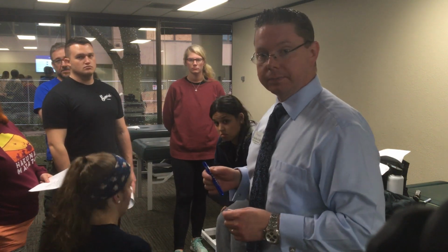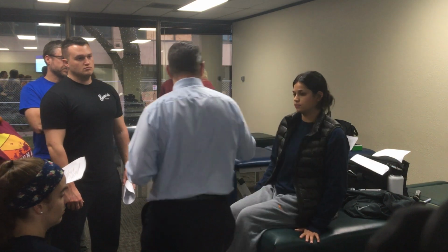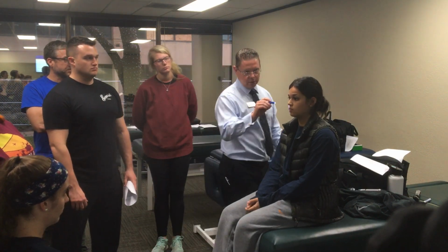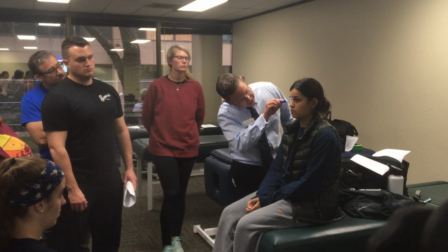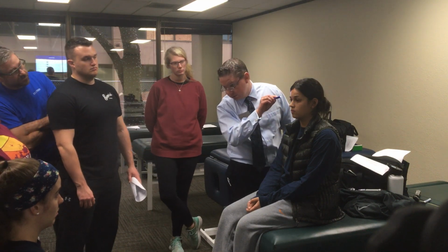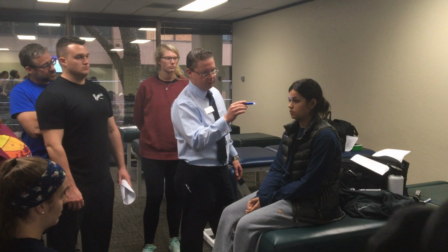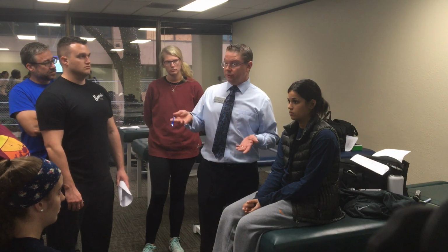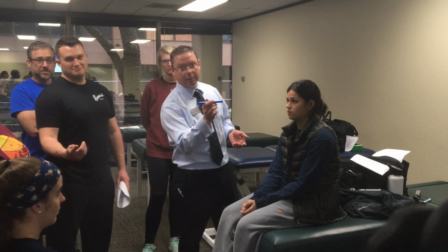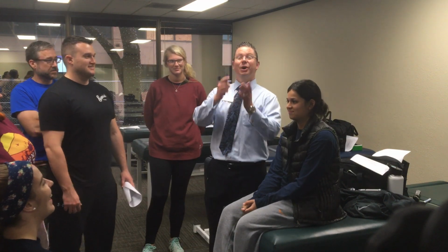Can you demonstrate tangential and oblique lighting on her right side, please? So, again here, what type of lighting is this? I'll shine it tangentially and look around to make sure it's lit up, right? And then here, oblique. And Dr. DeMack makes a good point. You always do this bilaterally, right? This is just more so for the video, but you always do this bilaterally. Thank you. All right, go ahead.